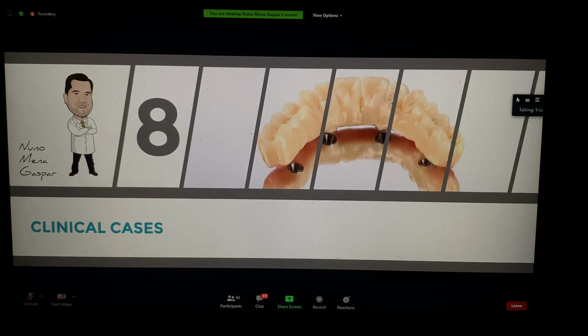I got another question. He thanks you for your great presentation, and he has one question. In the maxilla case, I usually perform an almost six-implant approach, even though in the molar area the residual bone height approximates 5 millimeters. I make an indirect sinus lift and place the implant simultaneously. This implant has 30 to 35 Newton. So should it be loaded, and is it a good prosthetic?